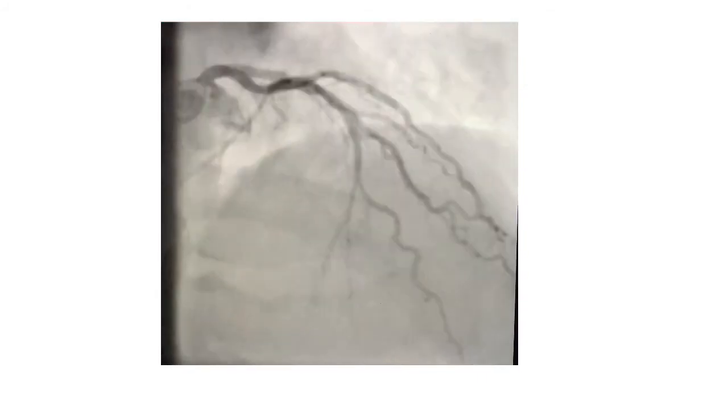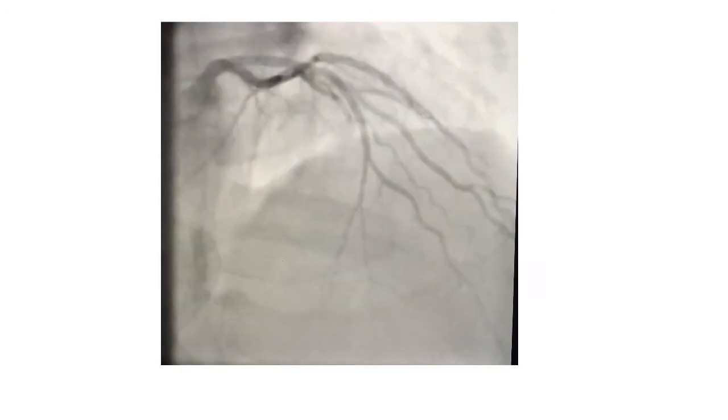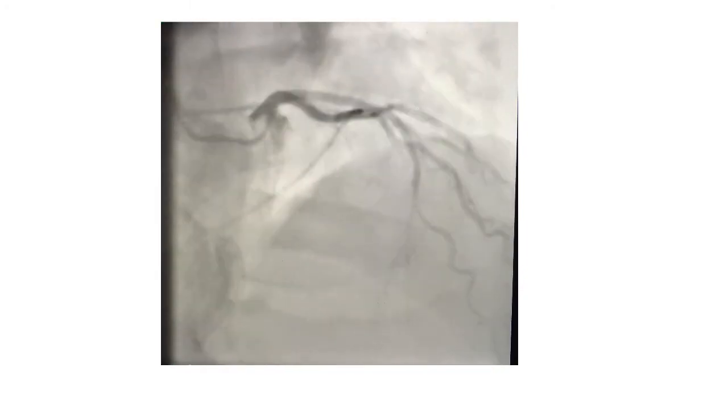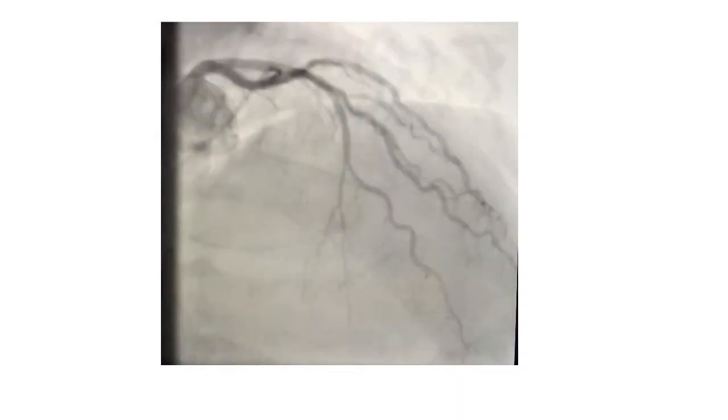Looking at live moving angiographic projections can be quite intimidating for the viewer. Over time, you will develop pattern recognition and experience, but even at the beginning, there's plenty you can do to help understand what's going on. In this case, you can see that at the beginning of the picture, the vertebral columns are seen roughly behind the catheter. This would suggest to you that this image was obtained in a flat projection. In other words, there's not too much LAO or RAO.